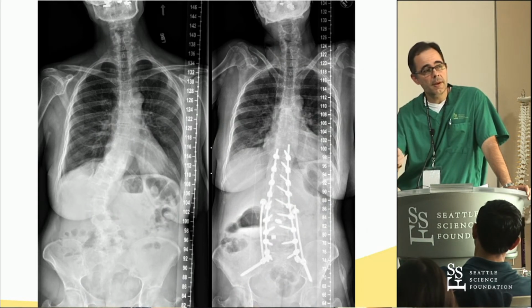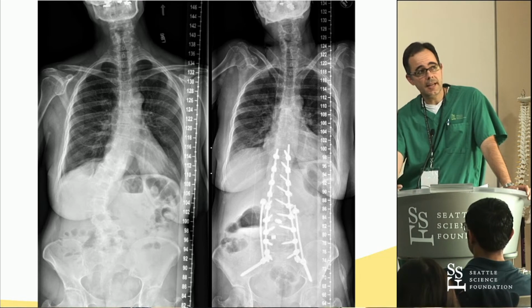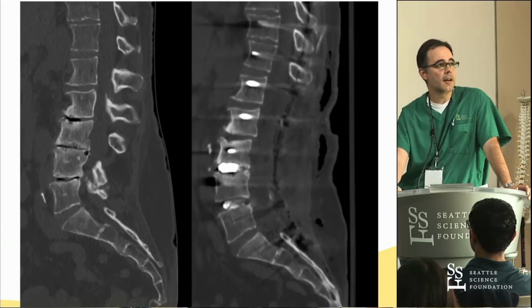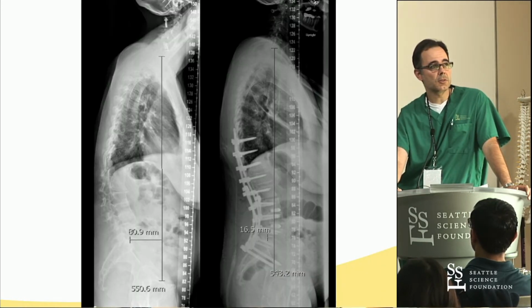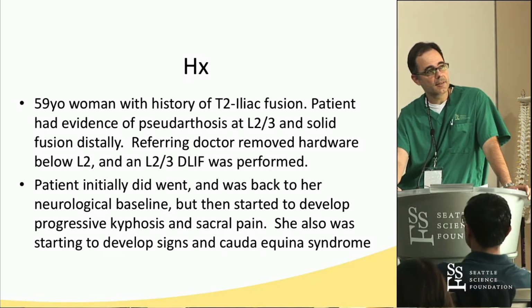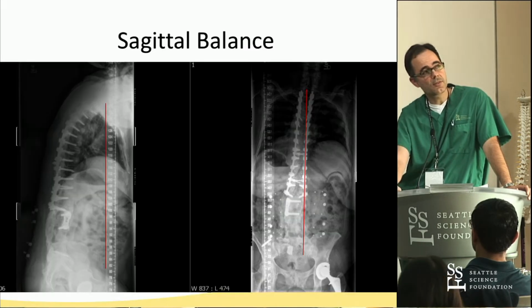So that's a comparison before and after. Again, showing that she did indeed have some reasonable flexibility to her spine, and showing the cages and the sagittal improvement. So this is a complex case of a patient. Actually, this case discusses that issue that we were discussing earlier.